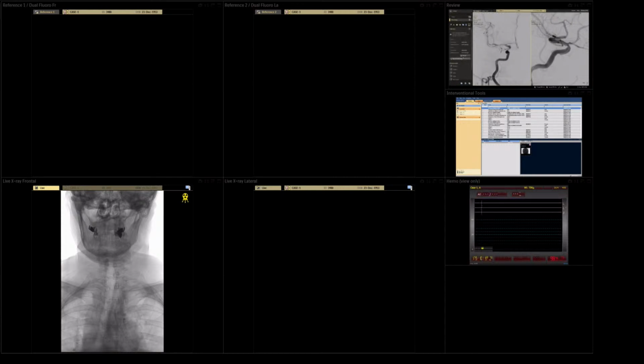Let's measure. This artery is nearly 2.7 millimeter, and stenotic segment is nearly 1.6 millimeter. Proximal part is bigger, and there is also stenosis in cavernous segment. Let's measure this part. It's 1.7 millimeter, and distally artery is 2.9 millimeter.